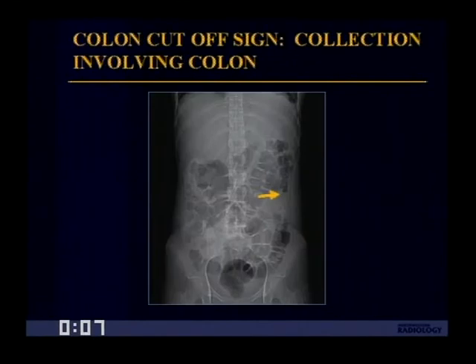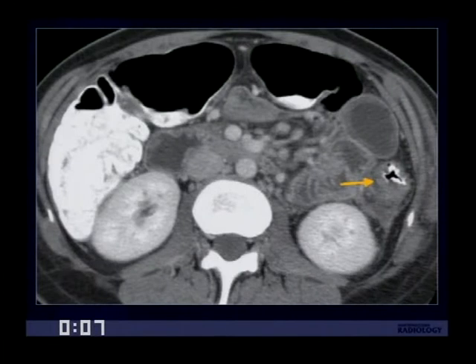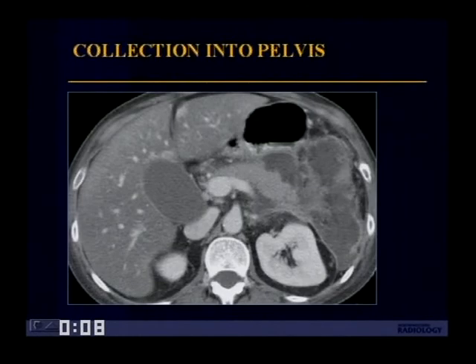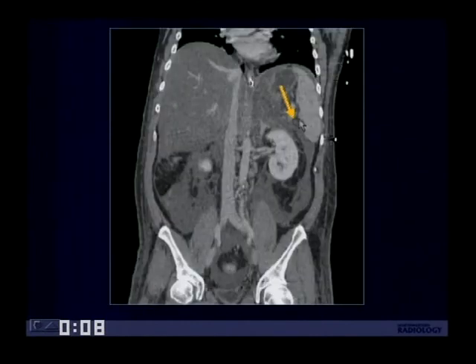Here's one of the few plain film findings — actually a scout from a CT examination showing the colon cutoff sign, where you see air within the colon and absence of air due to spasm. Here's the same patient showing evidence of pancreatitis with enlargement and heterogeneous enhancement of the pancreas, with dilatation of the transverse colon while inflammation extends to the descending colon, accounting for the colon cutoff sign. This patient with more severe pancreatitis has a large amount of fluid extending from the pancreas into the pelvis, nicely shown on coronal images.